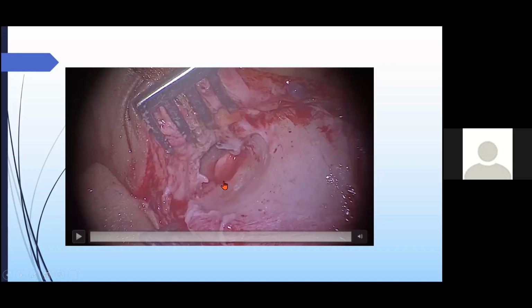And similarly, the drilling is continued here in the inferior canal wall, and on the anterior canal, one has to tilt the patient, and one has to be very careful because the anterior canal is very thin and can easily expose the temporomandibular joint. And if the capsule is exposed, then unnecessary jaw opening problems will be there, and movement of this jaw can affect the healing in our tympanoplasty surgery, and even the graft can get lateralized. So anterior canal wall, one has to be careful.